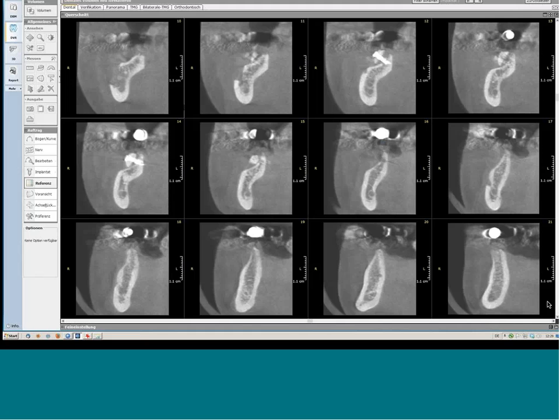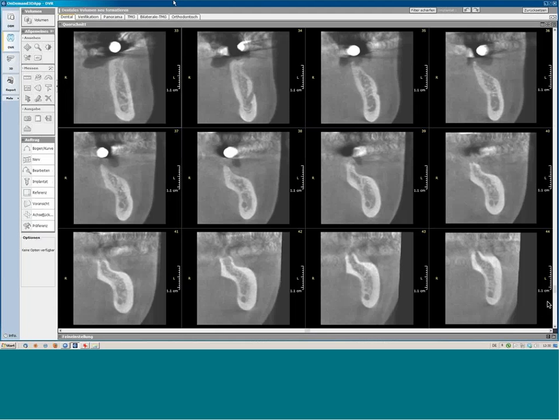On the contrary, we see in the next case that it was the other side, and here we see in addition some figure I will show you again in some minutes, this kind of lingual balcony, which is typical in a lot of patients in the side area, in the molar area. Here again, you all know this problem that you can perform here any perforation lingually, so just check out for these kind of balconies. This is a typical physiologic problem in lower jaws.